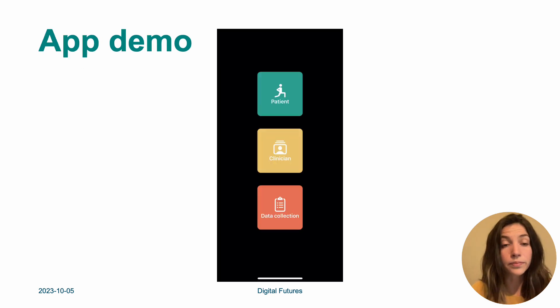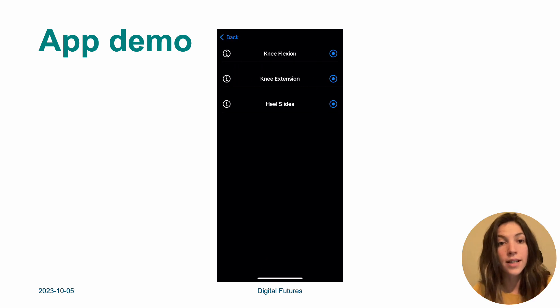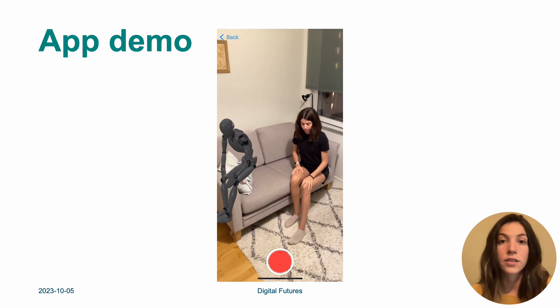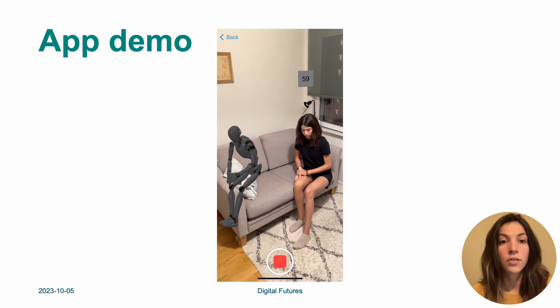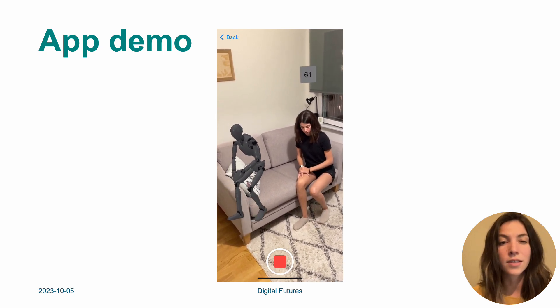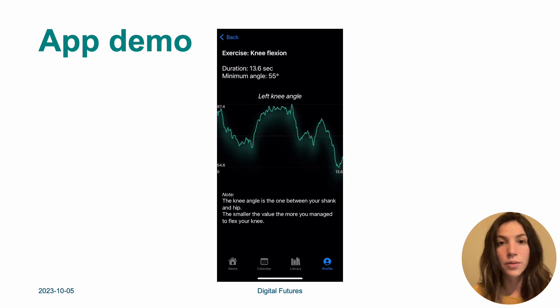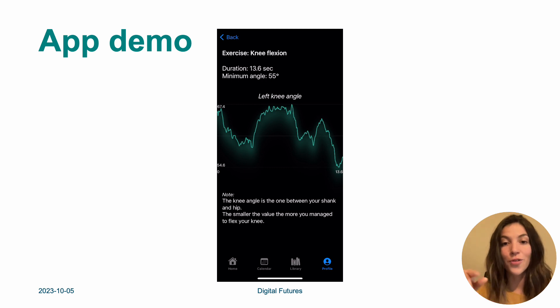Here we see an app demo. Right now we have three versions: one for the patient, one for the clinician, and one for data collection. In the patient view, the patient goes through their schedule with day one and day two. Inside day one they see the exercises, choose the first one — the knee flexion — and record the data so the clinician can later review it. Here we see the patient sitting on the couch trying to flex the knee, with visual feedback on the angle showing when the extension is not sufficient. Once the exercise is done, the user can go to their profile and see feedback for that specific exercise, including duration, the minimum angle achieved, and how this changes throughout the exercise. They also see their goal — the smaller the value, the more they manage to flex their knee.